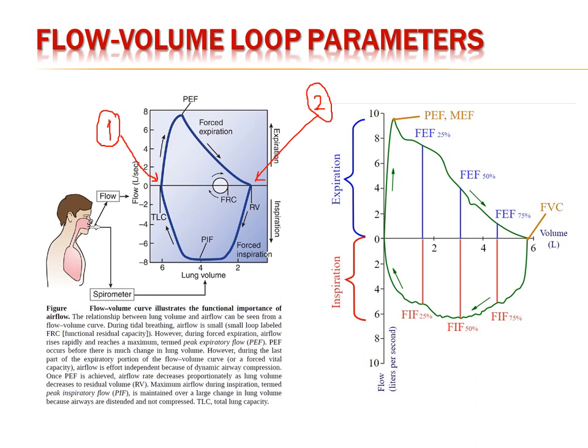It will reach the peak expiratory flow, and then the flow will be much less in magnitude, and the expiration will end at point 2.